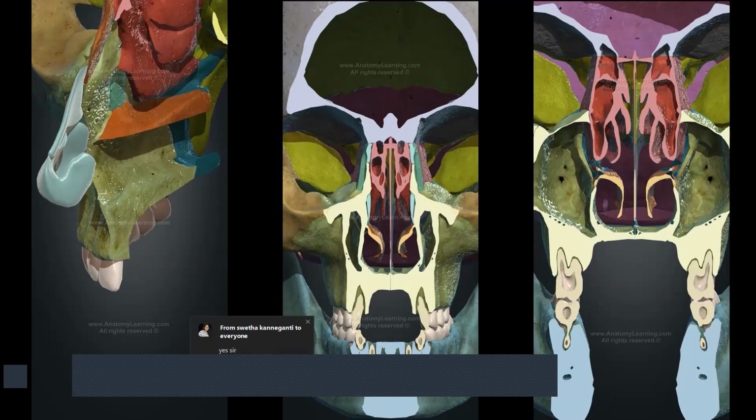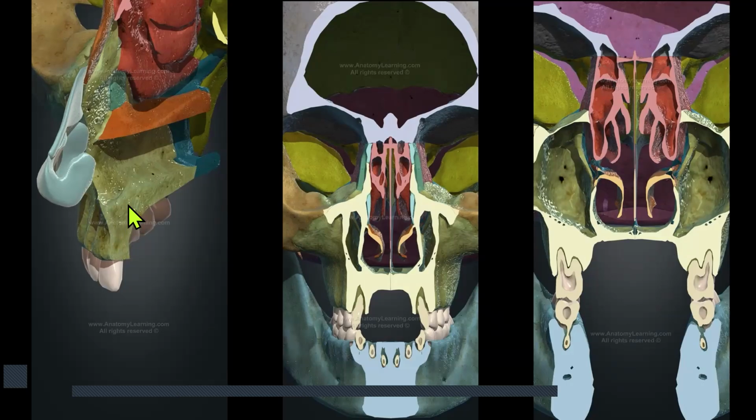Okay, so in the anterior region, the maximum implants we have placed are into the nasal floor, and that too from the anterior wall of this sinus to the anterior wall of the other sinus. That is the maxillary anterior region. And this nasal floor is spread from anteriorly to posteriorly.